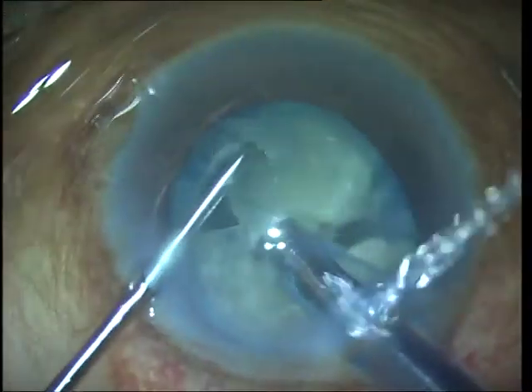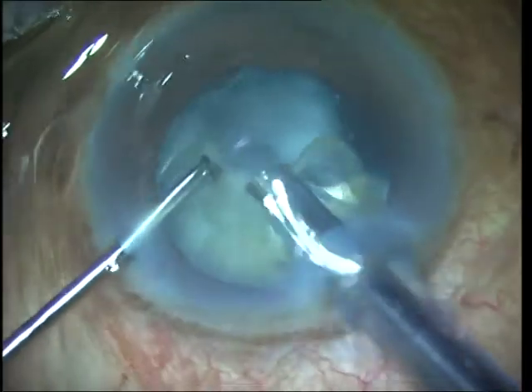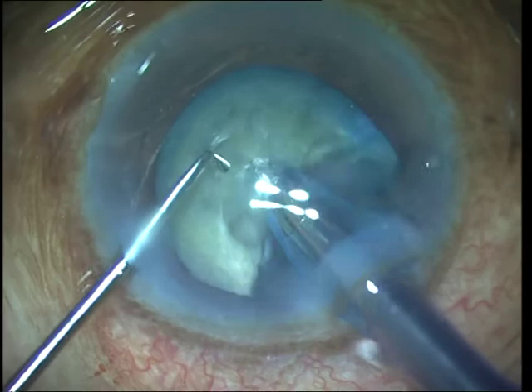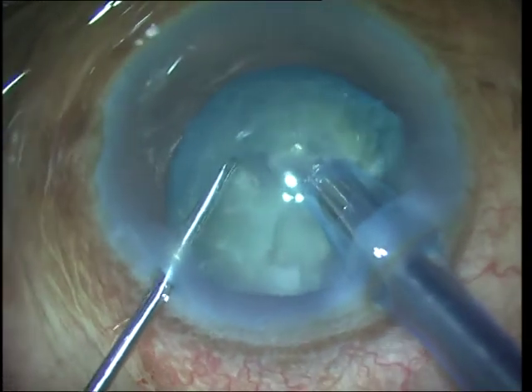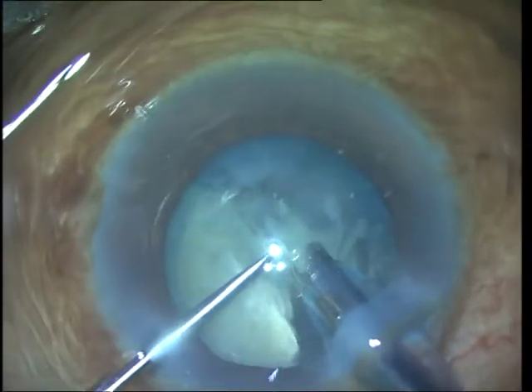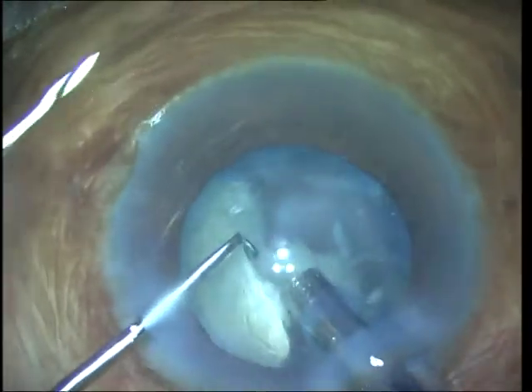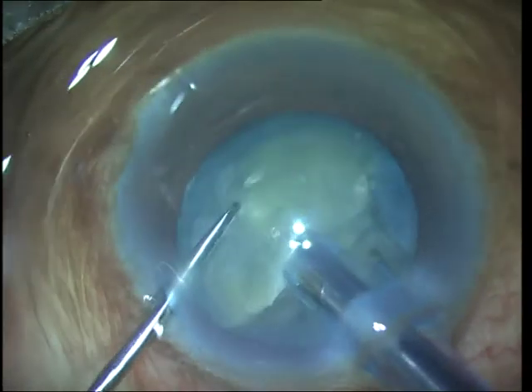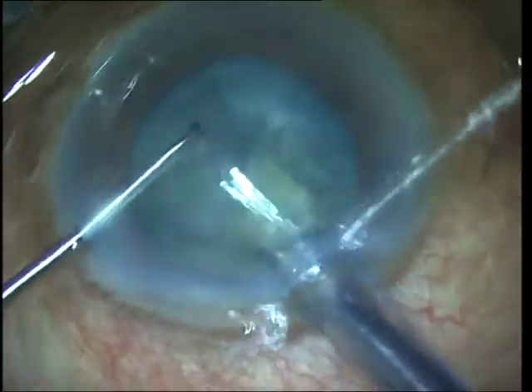The one I am using here is a Chang modified micro finger. I have no financial interest. What I do is take it gently around the equator of the nucleus and then bring it forwards towards the phaco probe to horizontally chop the nucleus into pieces. I chop it into small pieces and remove most of the pieces within the capsular bag while the majority of the remaining nucleus is still holding the capsular bag open.